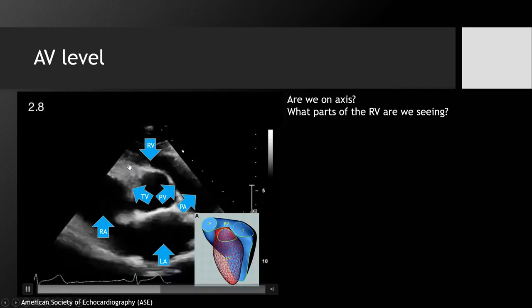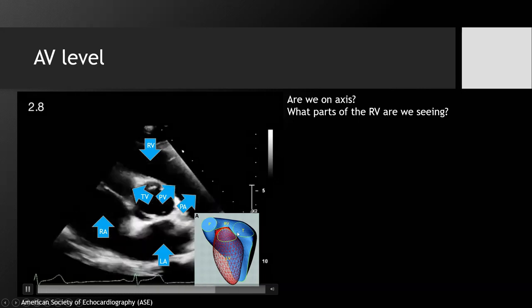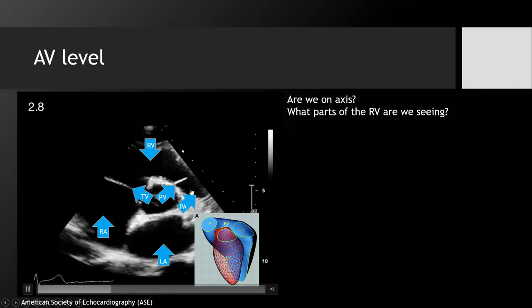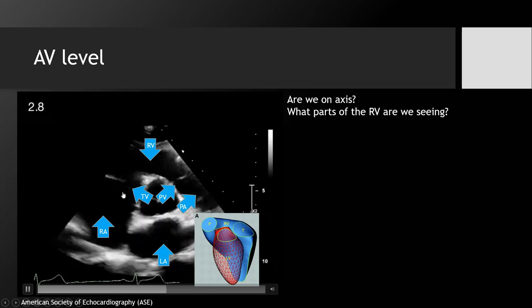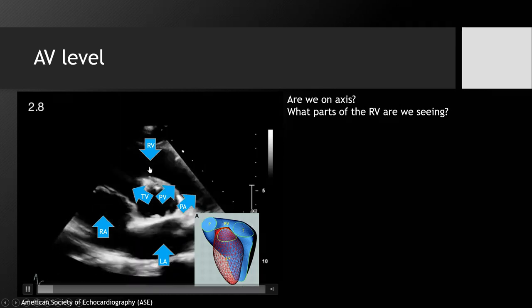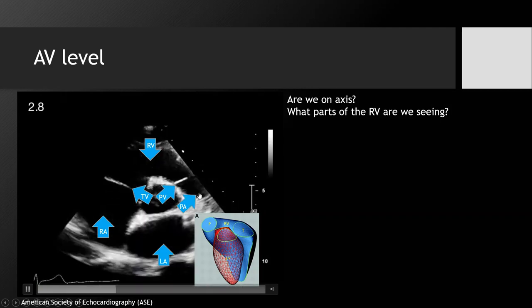Now take a look at this diagram that we showed you at the very beginning. This here, this crescent, is this crescent, right? This is where your aortic valve rests, and you're seeing this crescent shape. So this is also flipped. Here's tricuspid, here's pulmonic. Over here it's tricuspid, and this is pulmonic. That's just by virtue of how we've standardized holding the probe. But in general, what you're seeing here is the RA pushing blood into the RV, and it's going down, and then it's coming back up over here at the pulmonary valve level.